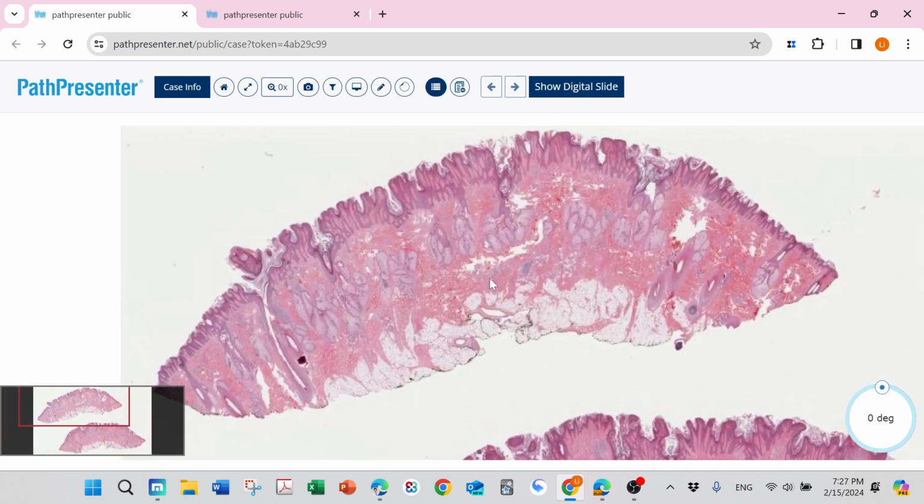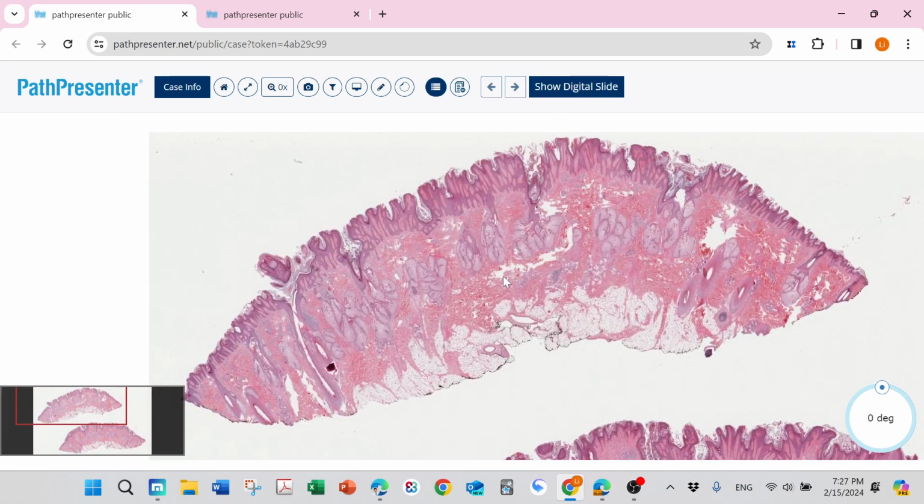Even at low power, you know it should be in the head and neck area, with really deep hair follicles. The subcutaneous fat is really thin; the distance from the subcutaneous fat to the epidermis is really short. Then we have these deep hair follicles.